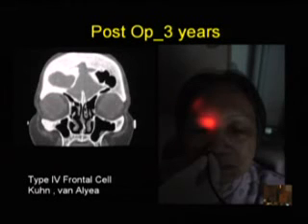Well, here it is. This is the patient about 3 years later. This is a flexible endoscope, and you can see that it's still lighted up and it has remained patent. It could be, for a skeptic like PJ, that we missed seeing a communication. I would think there'd have to be a communication between the two if you're calling that an additional cell. Either that or it's a supraorbital ethmoid cell. Okay, these are my two cases.